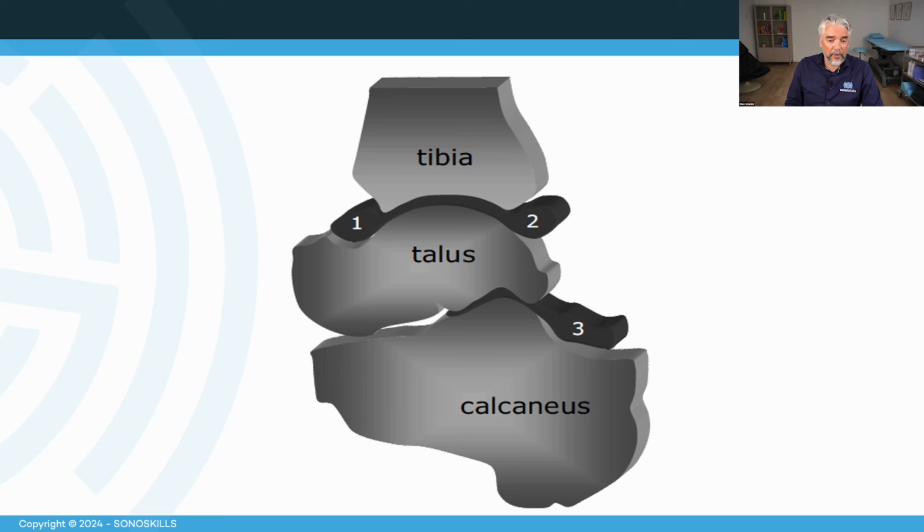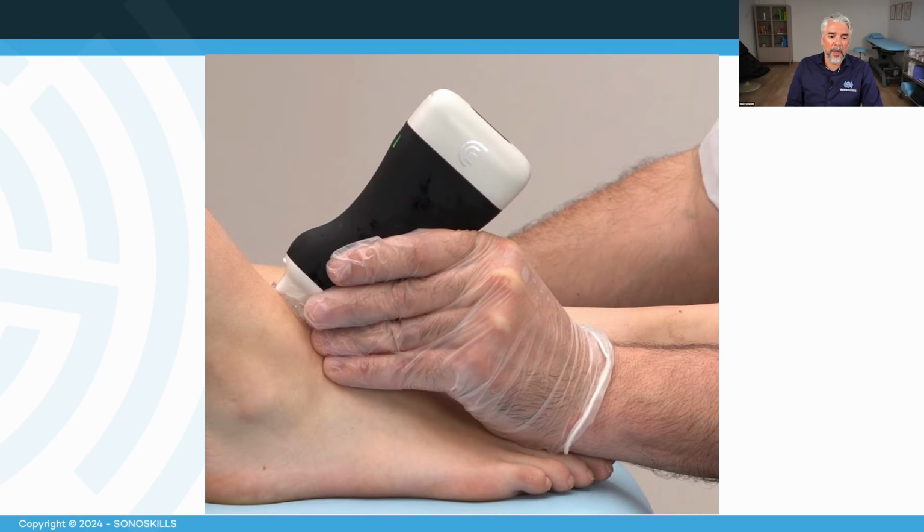Looking at the talar crural joint, we know that the anterior recess of the tibia of the talar crural joint is there. It's a capsular part where we can see effusions, but also cartilage damage, bone damage, and also signs of spurs. So anterior spurs could be either at this level or maybe here at the tibia level, and this limits also the dorsiflexion range of motion.